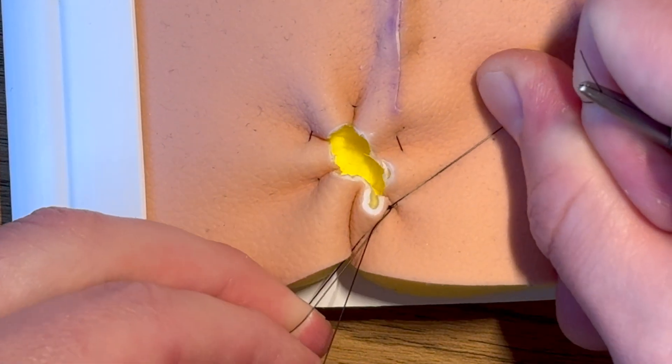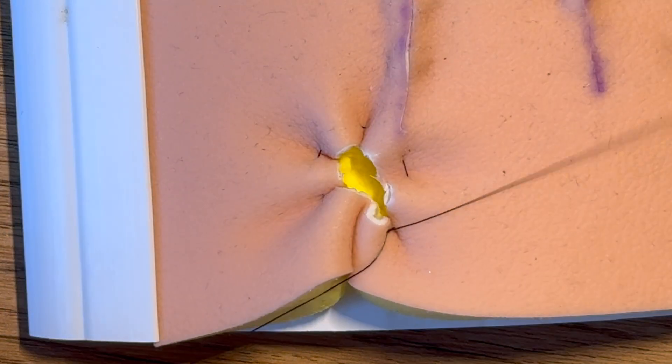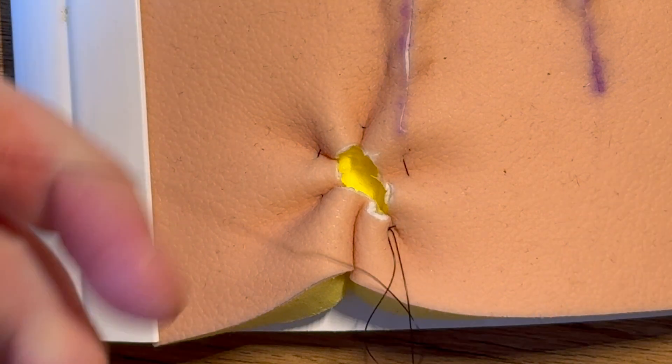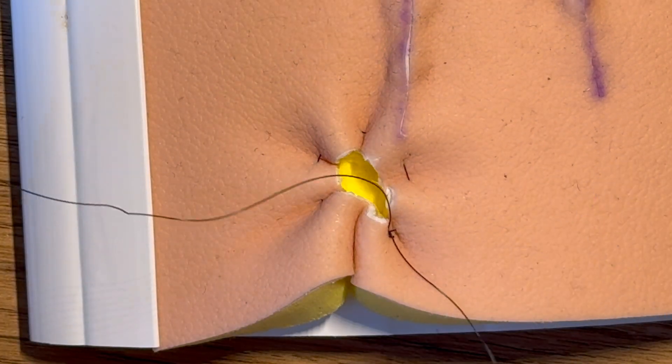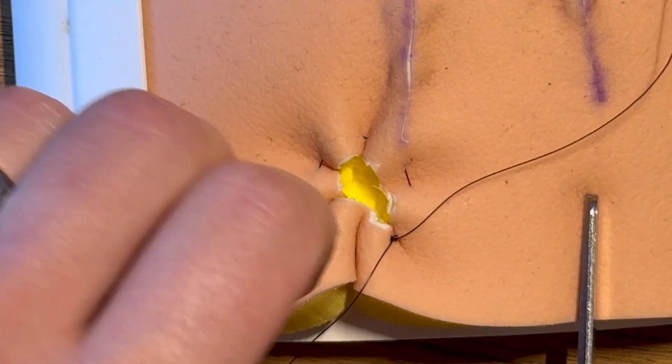And don't pull it too tight. Sometimes you might be able to completely close it but normally you're just going to quit while you're ahead but it's not quite closed. Don't leave as much spare as I have done here because that is very wasteful, but I'm just doing it quickly to make sure that it works for the purposes of demonstration. And there you have it.